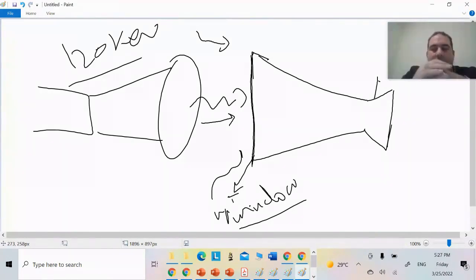Okay, great. The material that I will make the input phosphor, or the screen that will receive the X-ray photon, must be specifically specified. It has an attenuation property, or a characteristic in the absorption of this energy, which is distinctive.